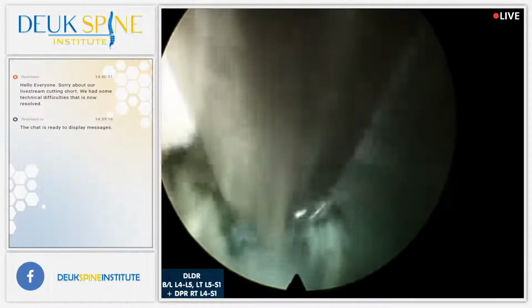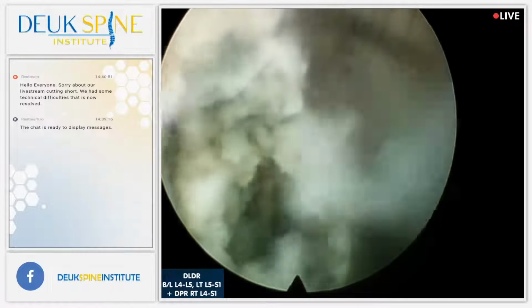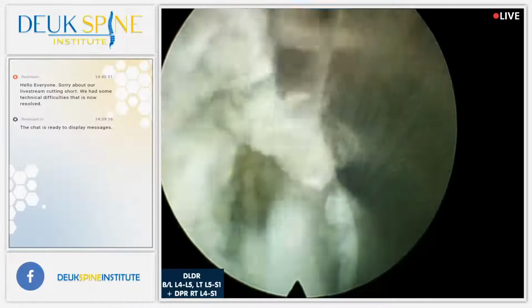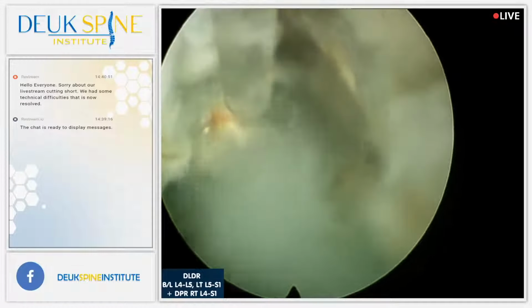I'm almost done stimulating him, Dr. Berndes. Okay. Just another minute, and then I'll be done stimulating. Then we'll go on to the next disc. He's very sensitive to pain, obviously.